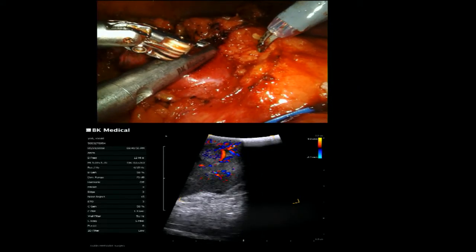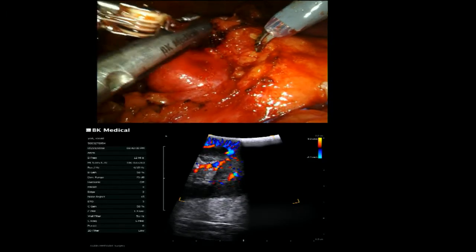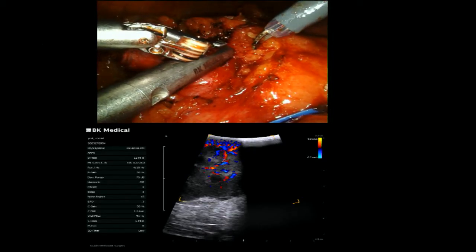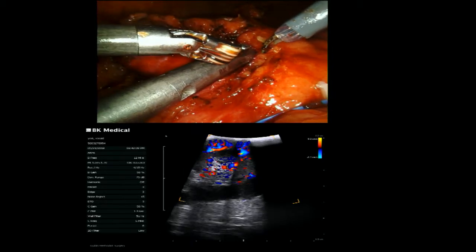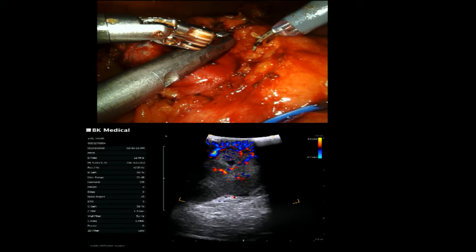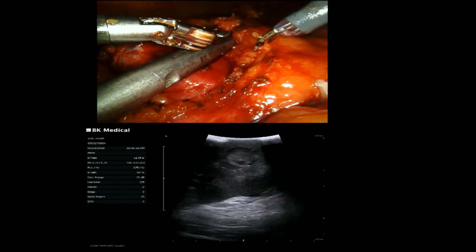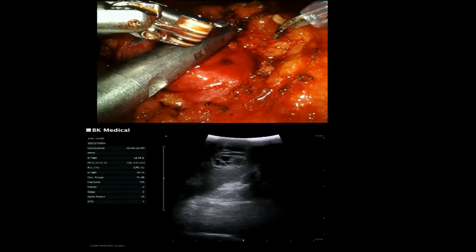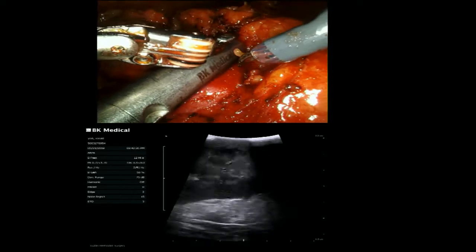So you still see tumor there. So there's tumor all the way down to here. Then we lose it. So right about here is where we're going to go. And I'm just going to turn off the color here for 1 second. So there you see there's still tumor right there. Right there, keep going, and then boom, we lose it. So we're going to cut down to about here.